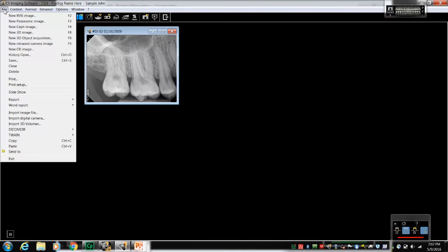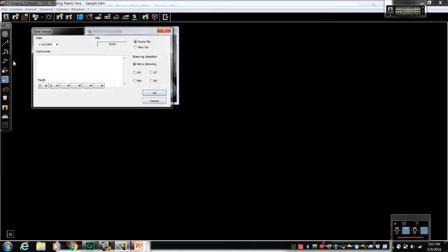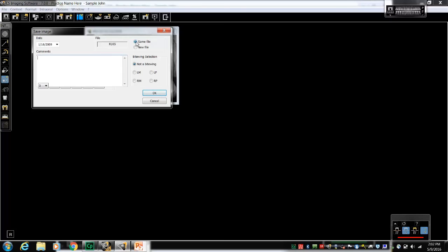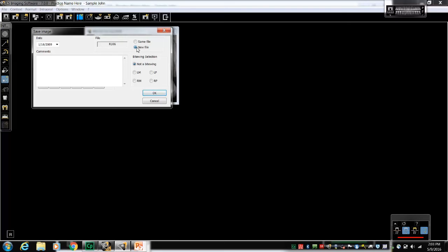File, Save. The dialog window appears. You can place a comment. You can put the necessary teeth numbers up to 6 teeth numbers. If you're correcting a previously saved image, you'll want to select same file so it overwrites the previously incorrect information. If you're wanting to make a copy, you can say new file and now you'll have one how it was originally saved and one how it was saved under the new file. If the image is a bite wing, you can select from any of these choices which will pre-populate the screen with the teeth numbers in the bite wing such as left molar, right molar, left premolar, right premolar. Just makes it easy for saving a single bite wing. So file save is one of many ways to save an image.